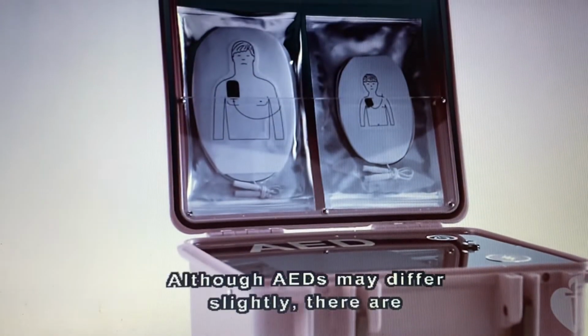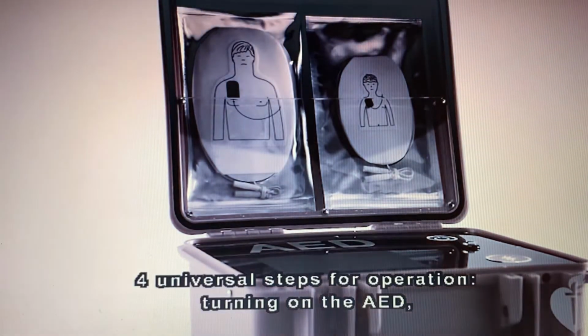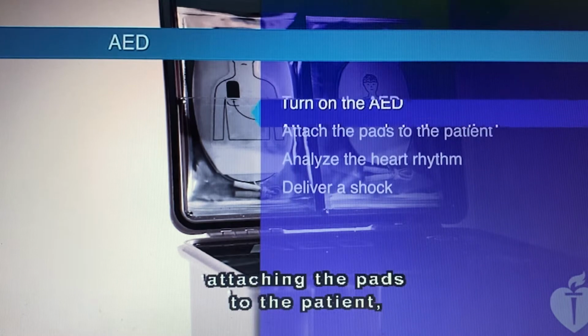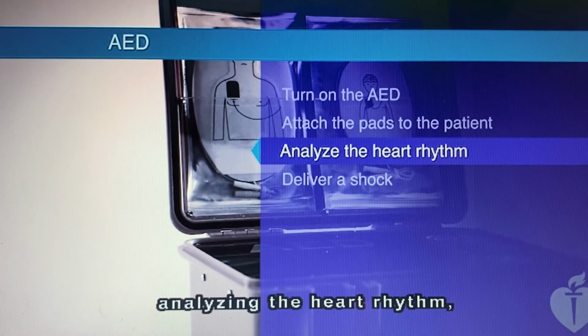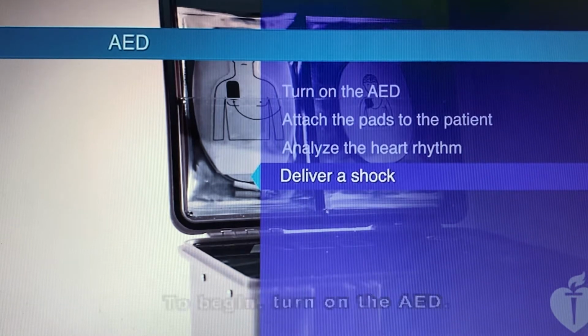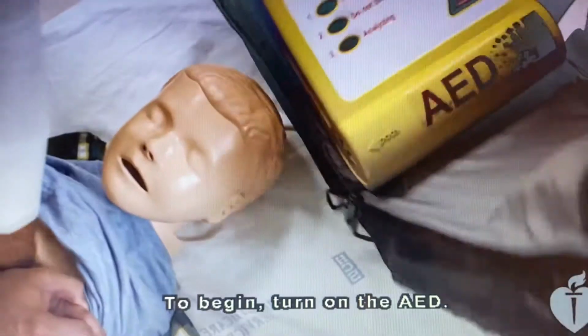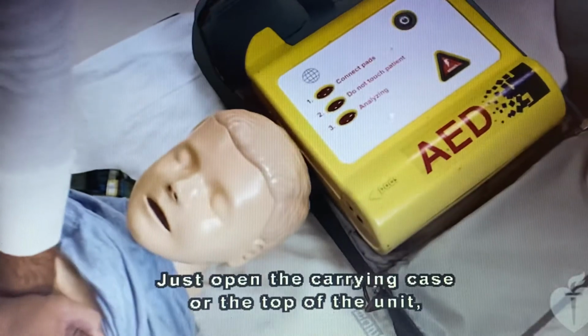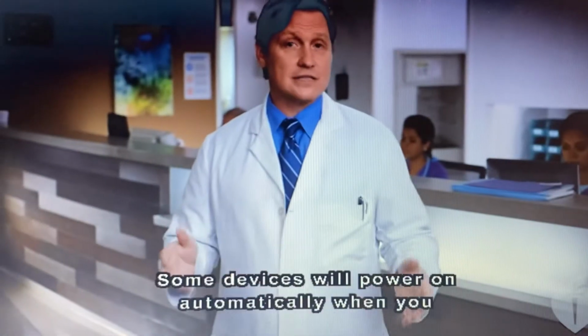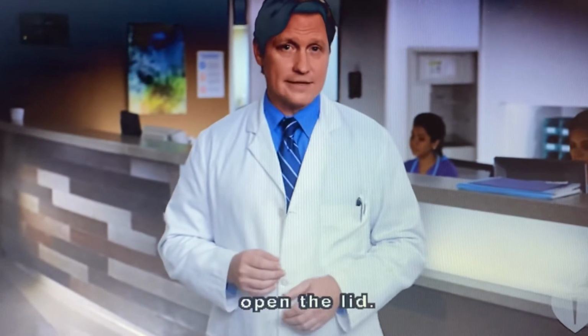Although AEDs may differ slightly, there are 4 universal steps for operation: turning on the AED, attaching the pads to the patient, analyzing the heart rhythm, and delivering a shock if indicated. To begin, turn on the AED. Just open the carrying case or the top of the unit and simply power on the AED. Some devices will power on automatically when you open the lid.